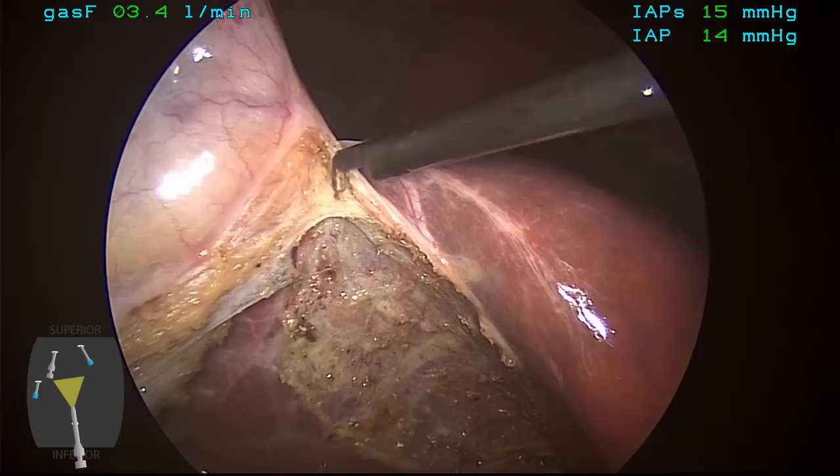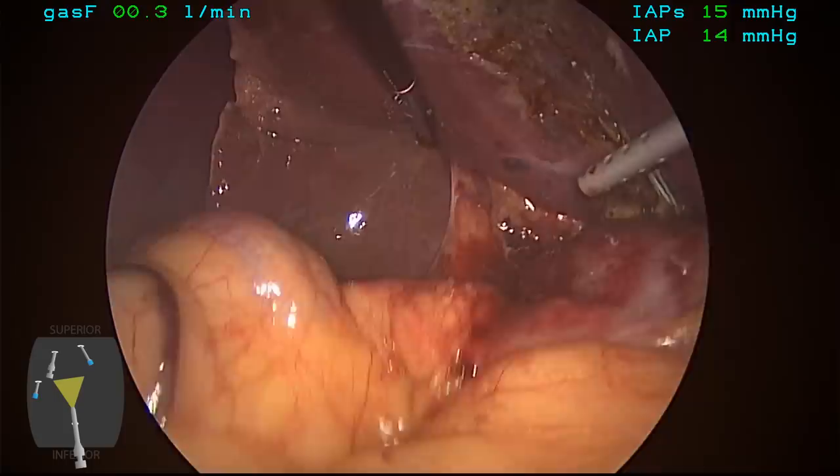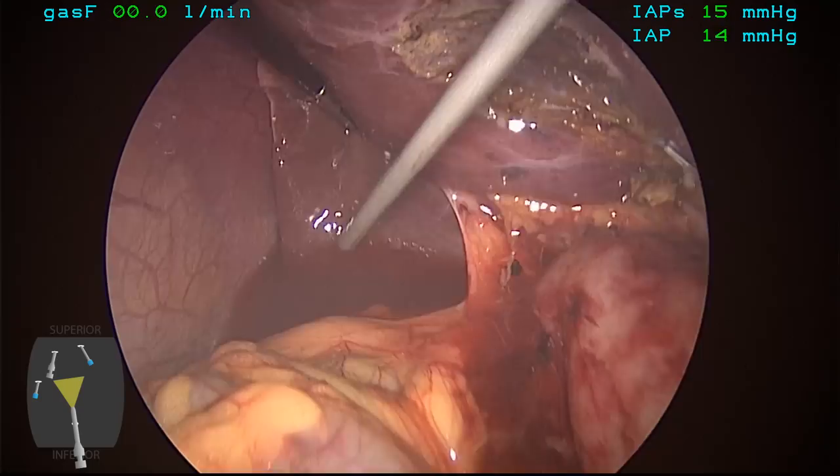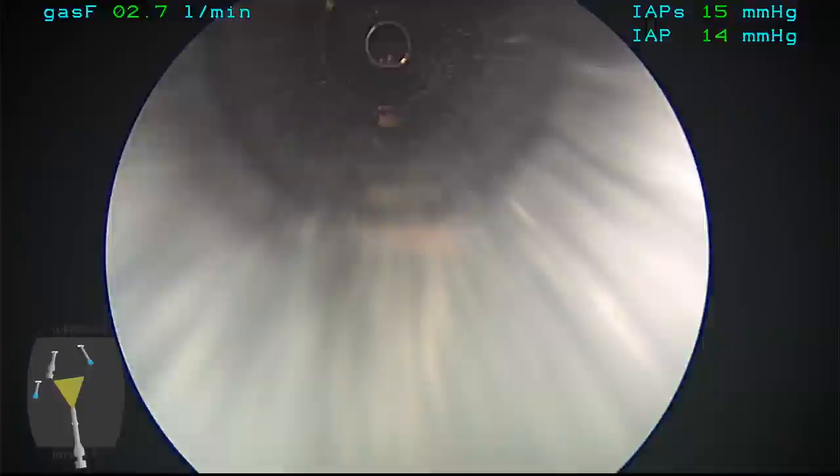At this point, just a few remaining attachments at the top of the gallbladder are divided, and the gallbladder is completely free. We elevate the liver, inspect the liver bed, irrigate with saline to make sure there's good hemostasis, that there's no bile leaking, and that our clips are securely in place. Irrigation is aspirated, and now the gallbladder is going to be placed in an entrapment bag for removal.